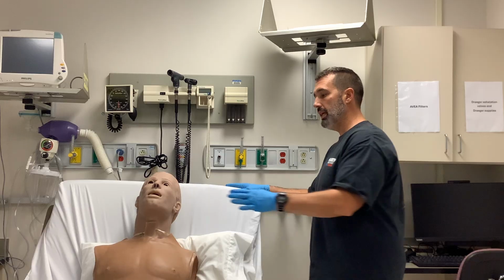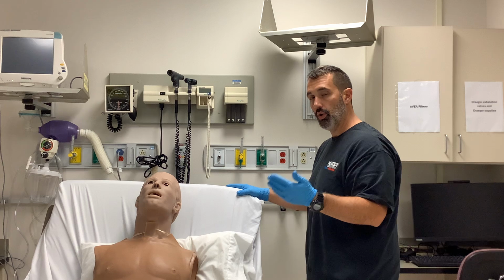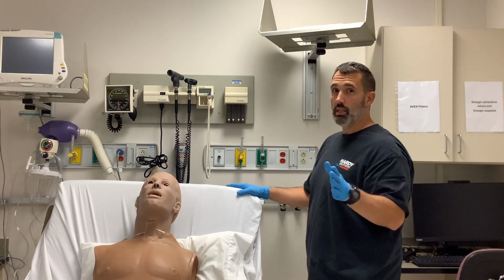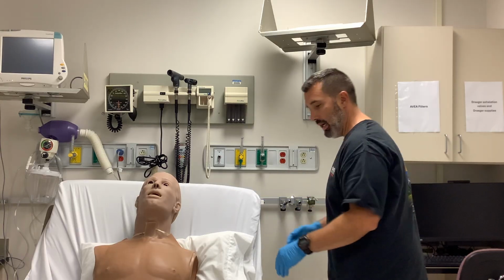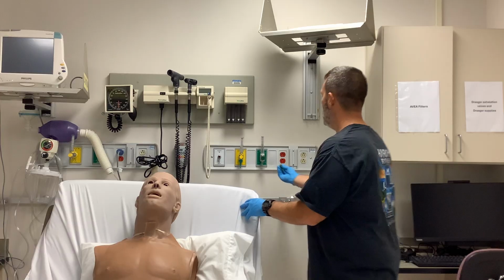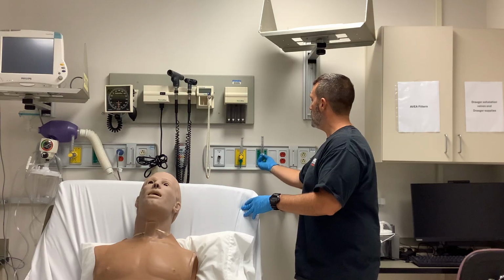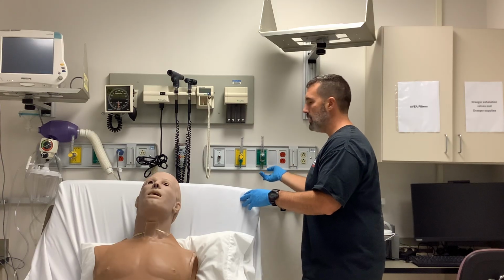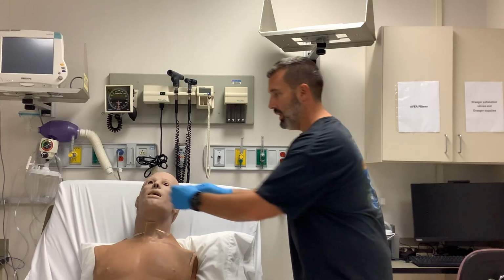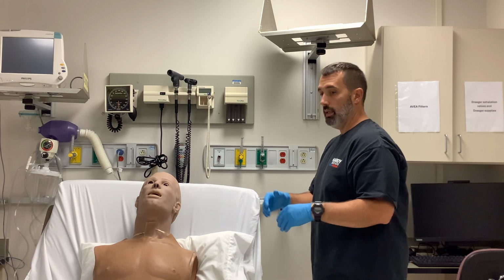Because if a patient's wearing a nasal cannula at 1 liter per minute, you can estimate that it's 24%, your FiO2 is 24%. With that being said though, what is the FiO2 through that nasal cannula? So if I have a nasal cannula hooked up to an oxygen flow meter and I adjust it, I'll stick with the example of 1 liter per minute. I place the nasal cannula on the patient. It's in their nares, and they're breathing in through their nose.